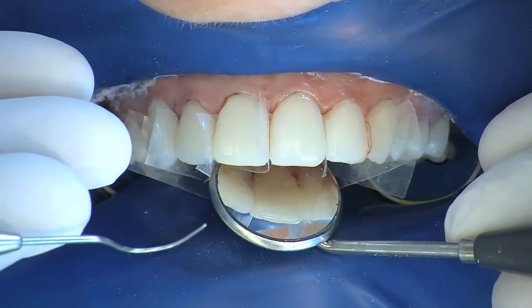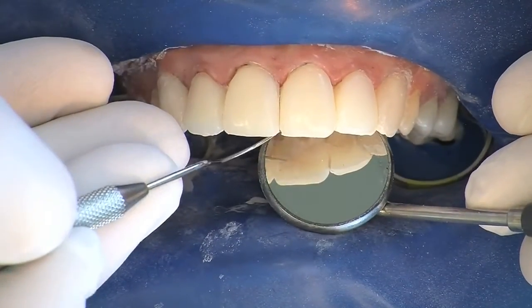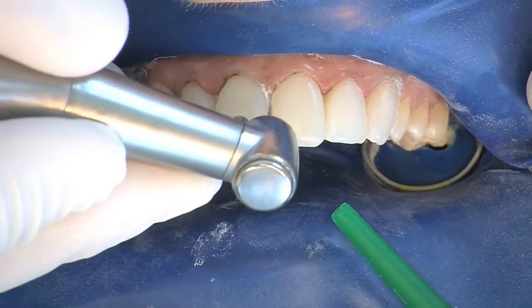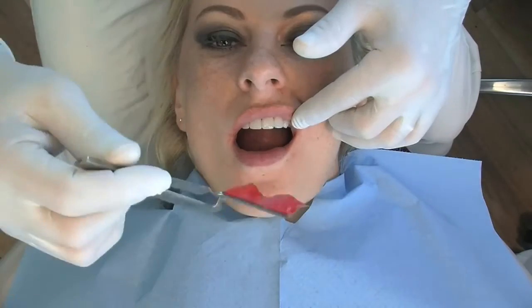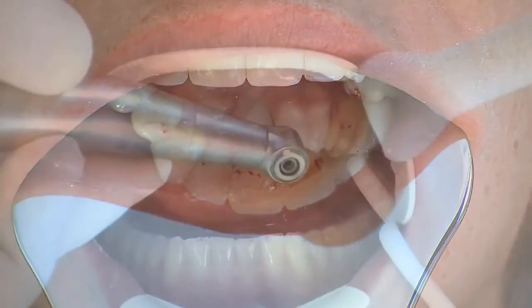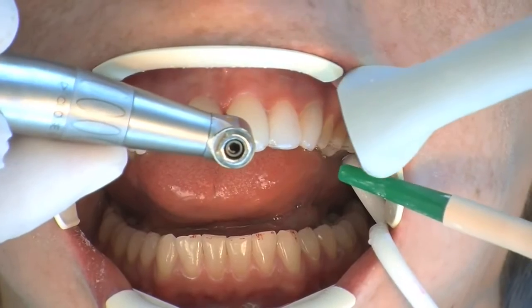Large excesses are removed palatally with a pear-shaped coarse diamond burr and the surface continuity checked by a probe. Cervical areas, especially towards the interdental areas, are treated with a thin 40 micrometer flame-shaped diamond burr. Occlusion is checked before polishing, and occlusal contouring is carried out if necessary.